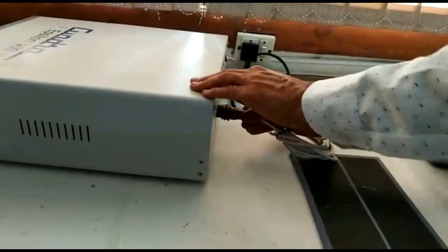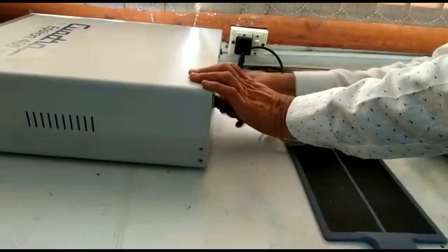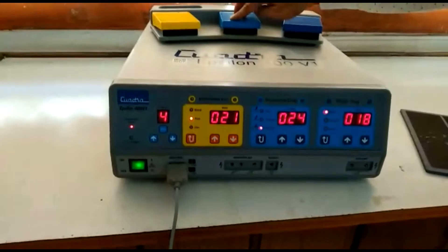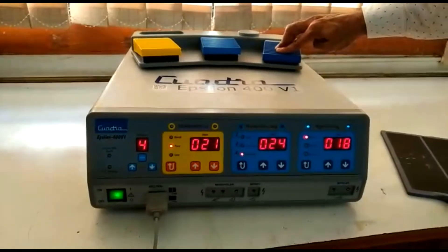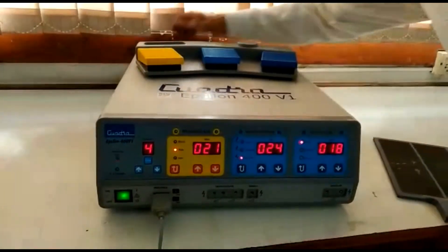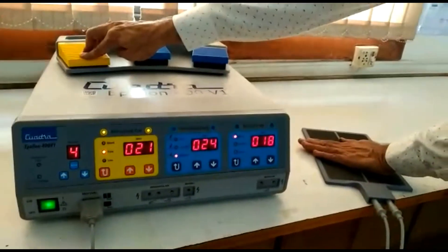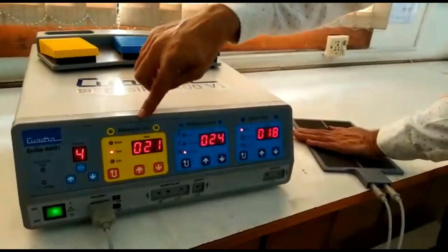The foot switch is connected on the back side of the machine. Fit it properly, press it, and tighten it to ensure proper contact. If you try to activate monopolar power using the foot switch without sufficient patient plate contact, you will get only an alarm and no output. But if the contact is sufficient, you can see the activation indicator as well as hear the audio sound which confirms that output is being delivered.